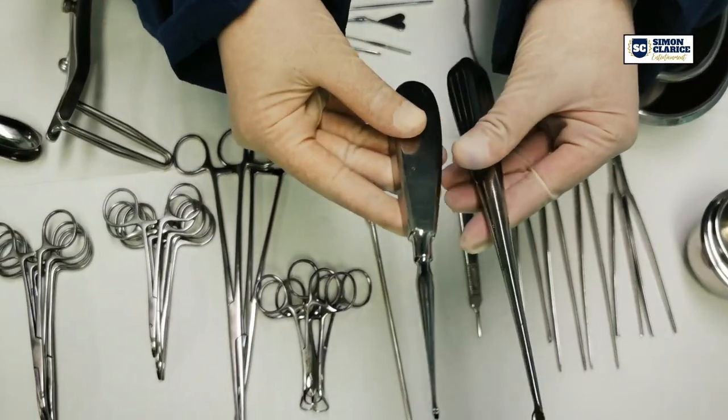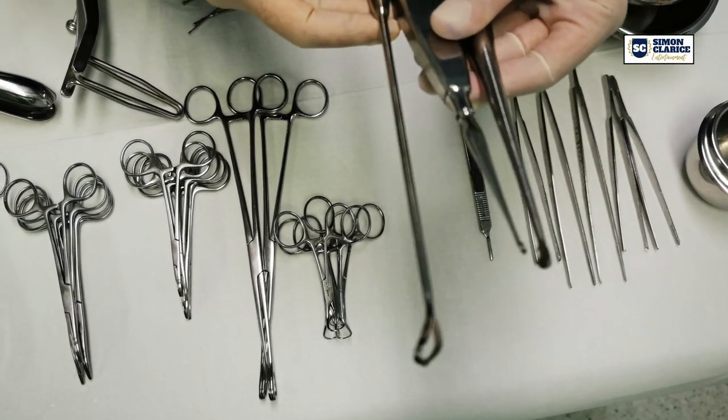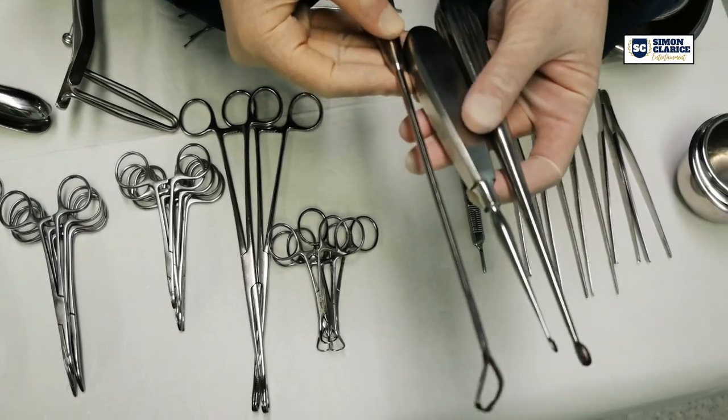Two bone curettes and a uterine curette. These curettes are used to scrape or to debride a tissue.